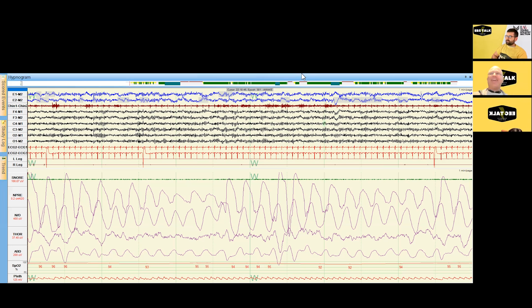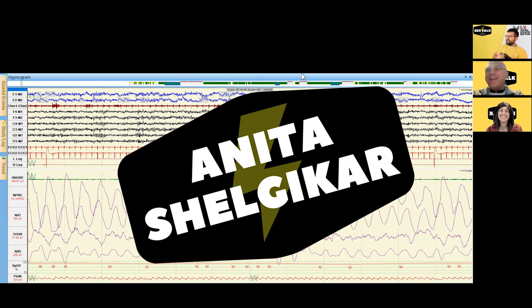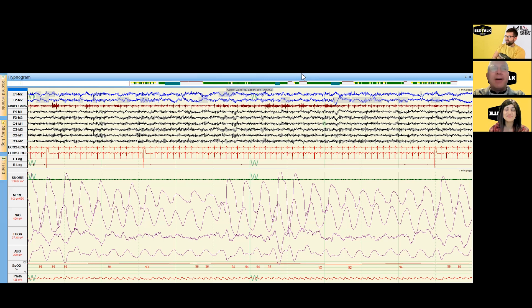Hey Fabio, how are you doing? I've been snoring, I think, and not sleeping too well, so I decided to get a sleep study on myself. We don't know how to read sleep studies — we better bring in a specialist. There are a lot of extra signals here; we're used to the EEG but we don't know what we're looking at.